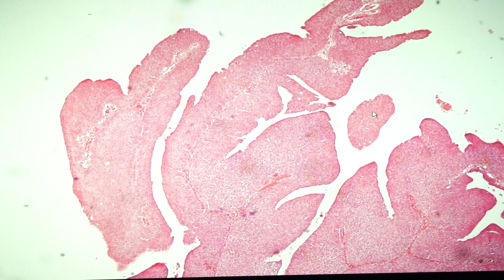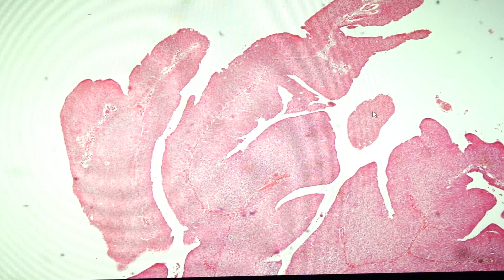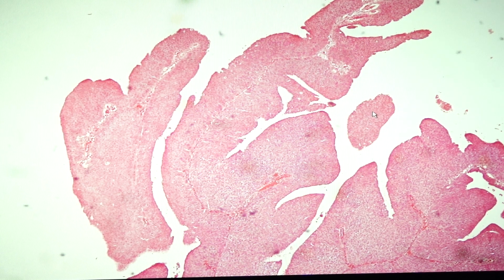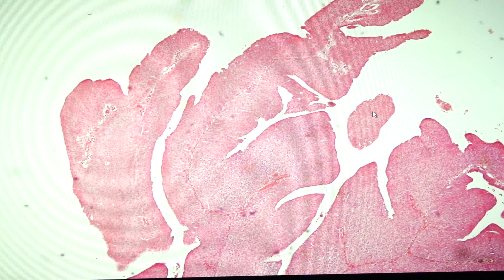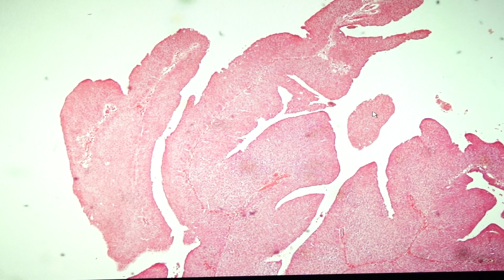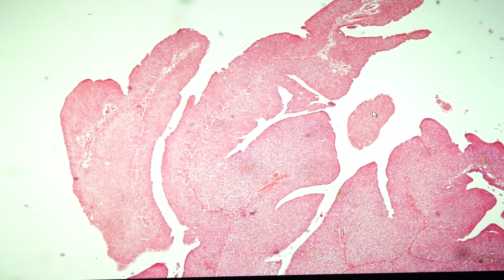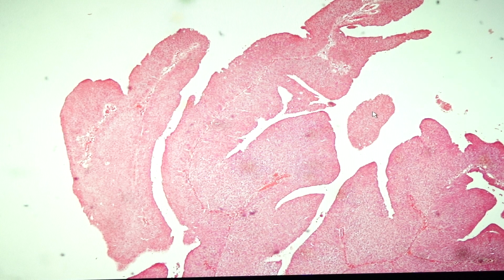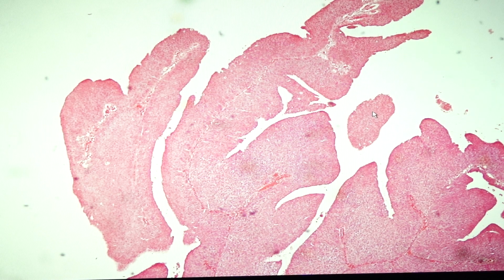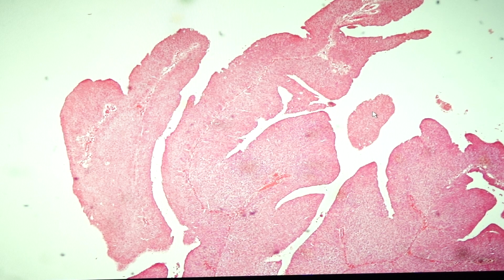This is a continuation of the malignant epithelial tumors. We are going to discuss four slides for this particular session, and I'm going to follow it up later with another session for soft tissue tumors and the miscellaneous malignancies. We are going to tackle slide 49, slide 240, 239, and 232 — that would be transitional cell carcinoma, follicular carcinoma, papillary carcinoma of the thyroid gland, and seminoma.